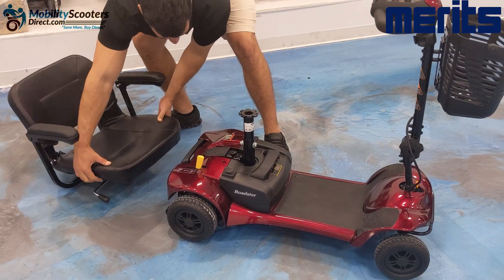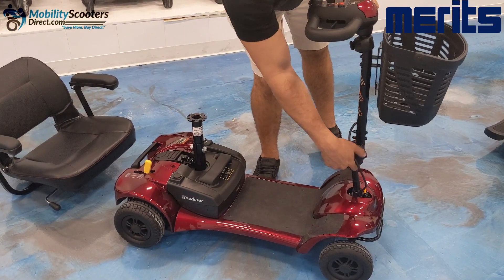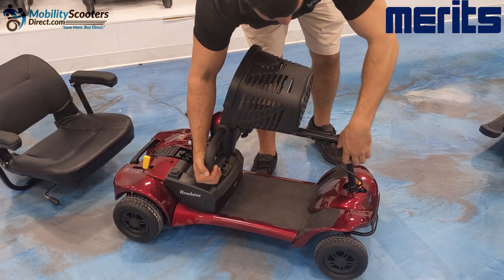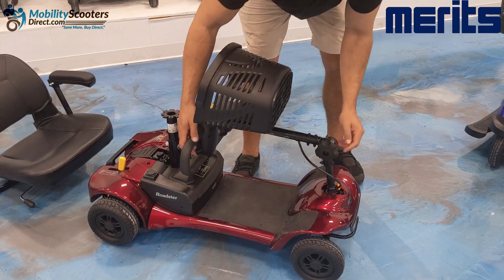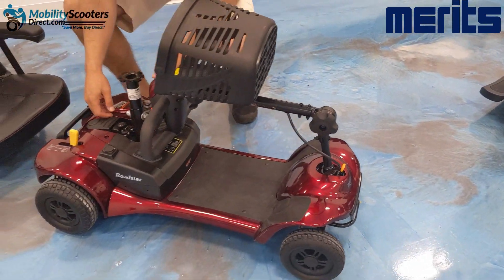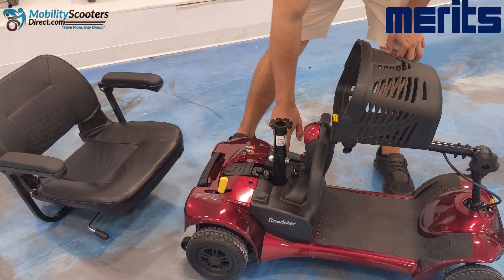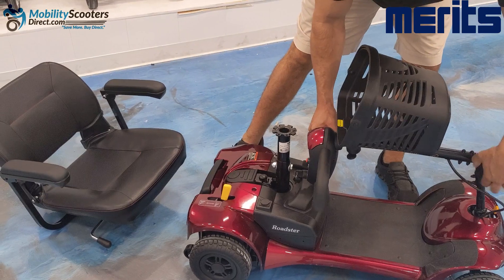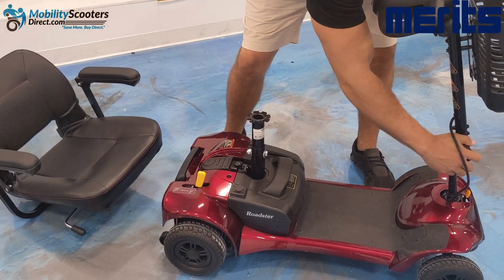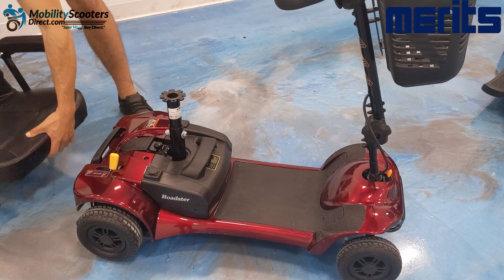The four-wheel version is nearly identical to the three-wheel, except that it has four wheels and is a bit more stable. The turning ability is not going to be as sharp with the four-wheel, because the three-wheel has a much better turning radius and ability to take sharper turns, having only one turning point in the front instead of two. Other than that, the Roadster three-wheel and four-wheel are nearly identical and work the same way.